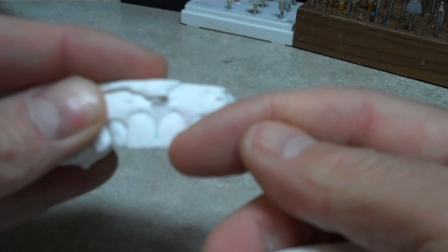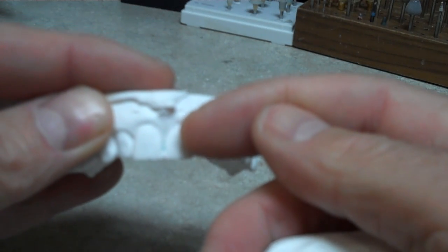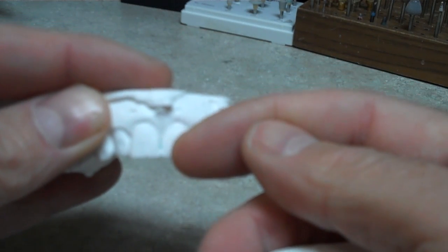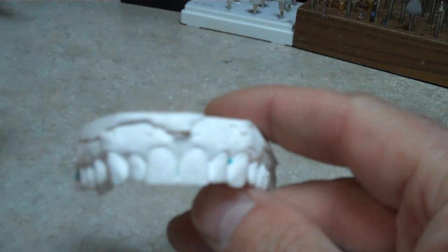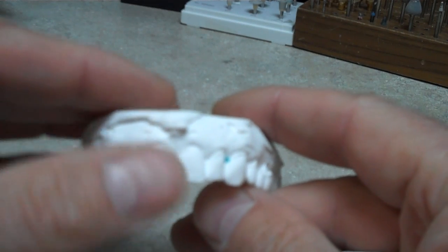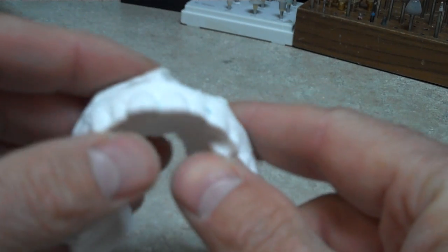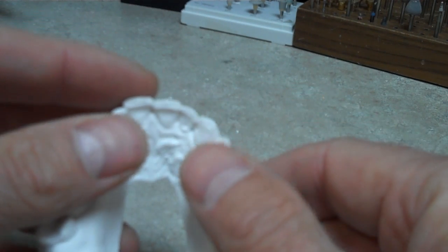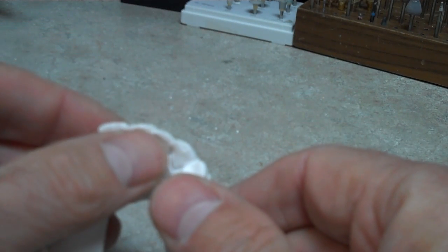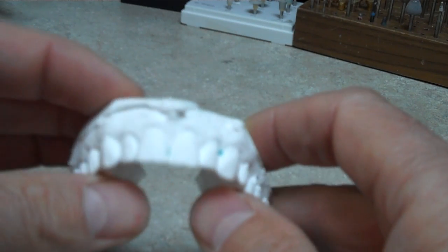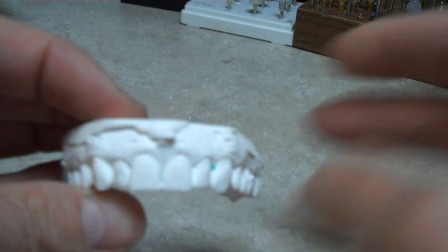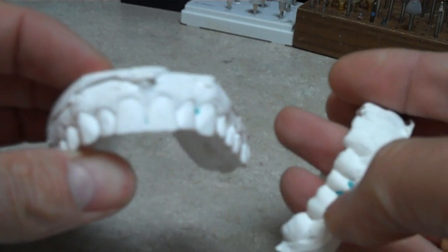The current measurements on the central incisors are about 10 millimeters. Now, while that is a little below average, I could probably attribute that to some of this lingual wear and some unsupported facial enamel chipping off.